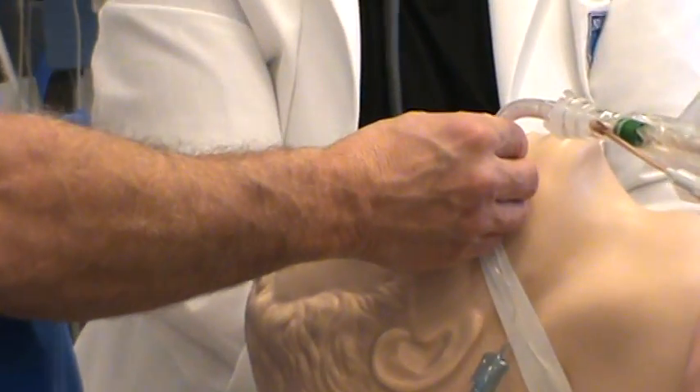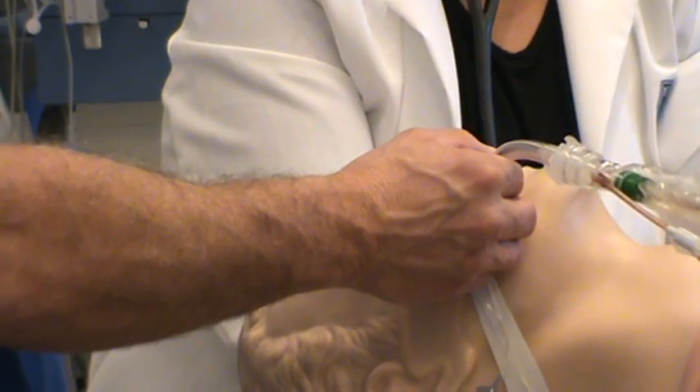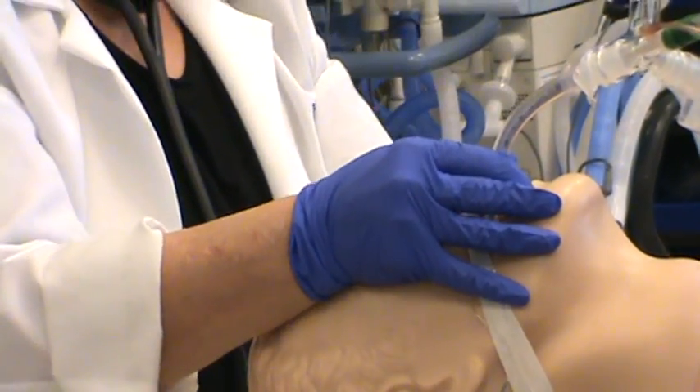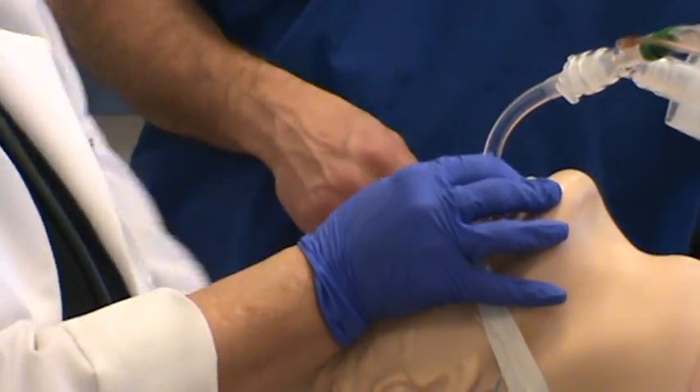Now I'm going to get Diane to take the tube and secure it while I move to the other side.